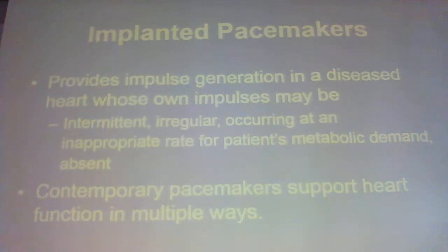Now, here's the thing. People who have pacemakers have a card, they carry a card in their pocket that has these things on it. So if you didn't know, you just knew they had a pacemaker, they should be able to give you a card, and you should be able to look at that card, compare it to your chart, and figure out exactly what kind of pacemaker it is, what it does.